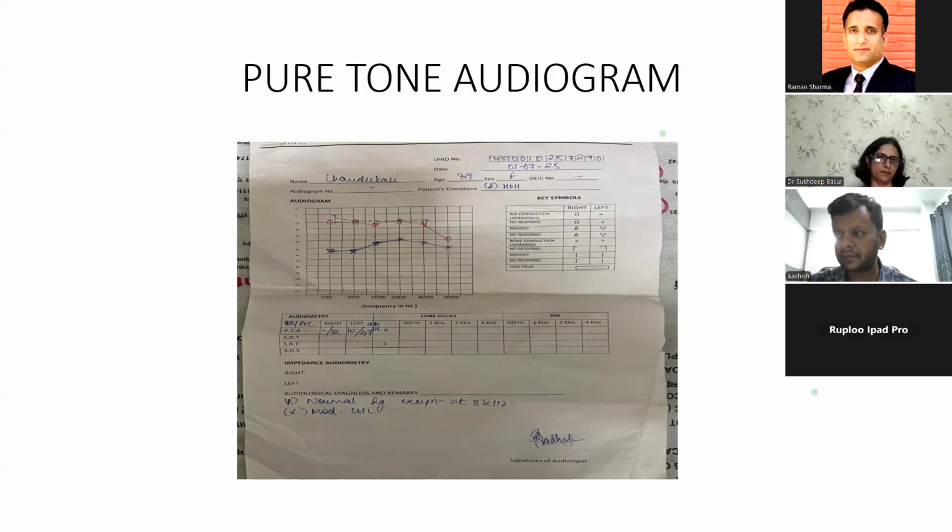What about the mastoid tip? Mastoid tip cells must be displayed inferiorly. One very important structure you are missing, which is required for cochlear implantation: posterior tympanotomy approach. Close to the facial recess, lateral semicircular canal. No, sir. A structure which is visible. You have to see that structure before displaying that part. You cannot proceed further for posterior tympanotomy.